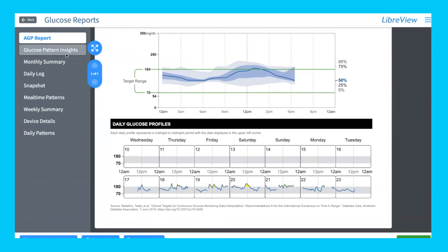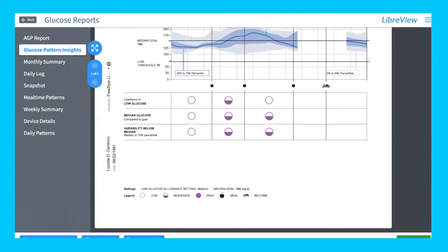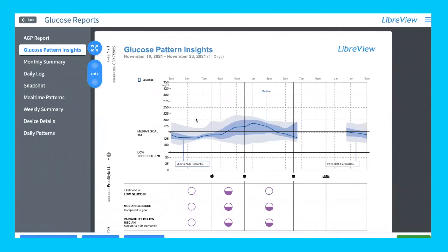On the left-hand side of the report, there are a bunch of different options to click through to explore your data further. Looking at glucose pattern insights gives you a deeper dive into the last graph. Your glucose levels are shown on the left from zero to 350, with your target range marked by darker bold lines. If you see a break in the data, that could mean your sensor wasn't working or you changed your sensor. The blue line is your median or average glucose, which helps you understand when you're spiking throughout the day.